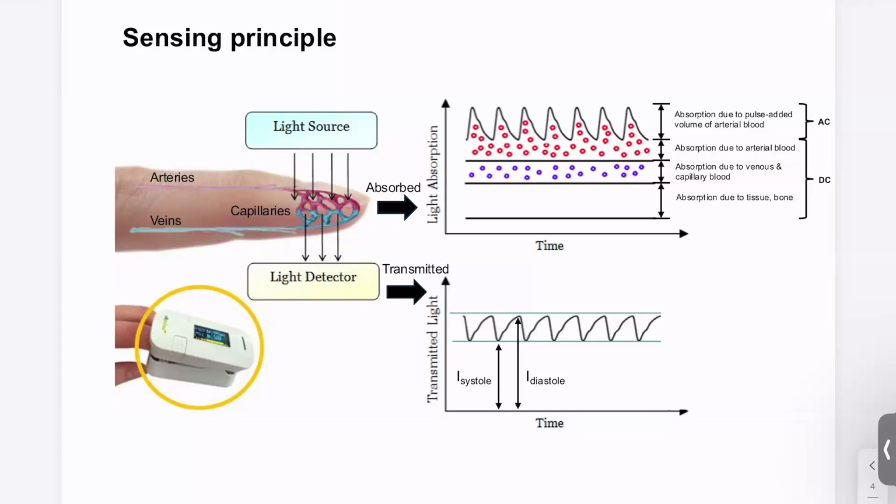So essentially what's going on here is that your heart is pumping blood, and that creates a chain of pulses. The pulses will travel down arteries and then reach capillaries. Capillaries are like a sponge. They consist of millions of micro-scale blood vessels.